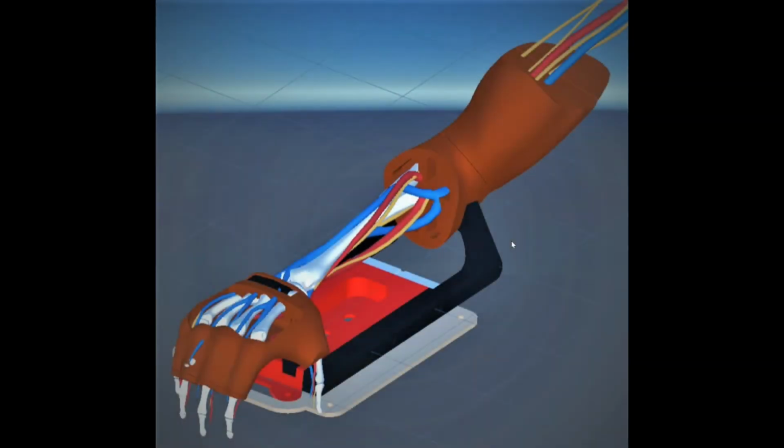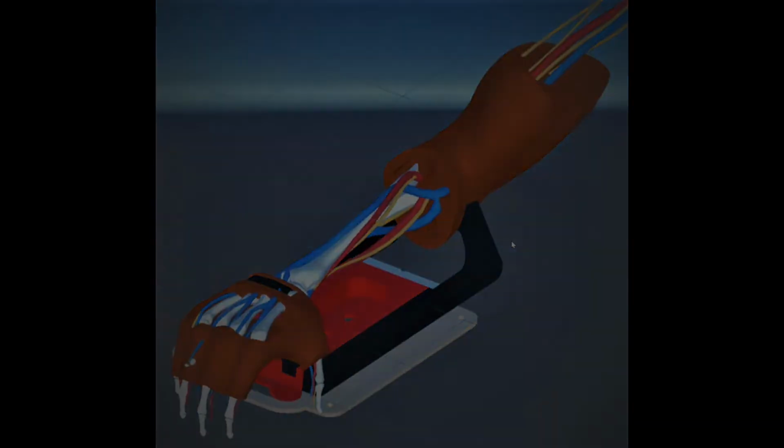The ultrasound-guided IV access simulator was also designed for future addition of arterial access, peripheral nerve blocks, and Botox injections to the upper extremity with the anatomically correct muscles and nerves.